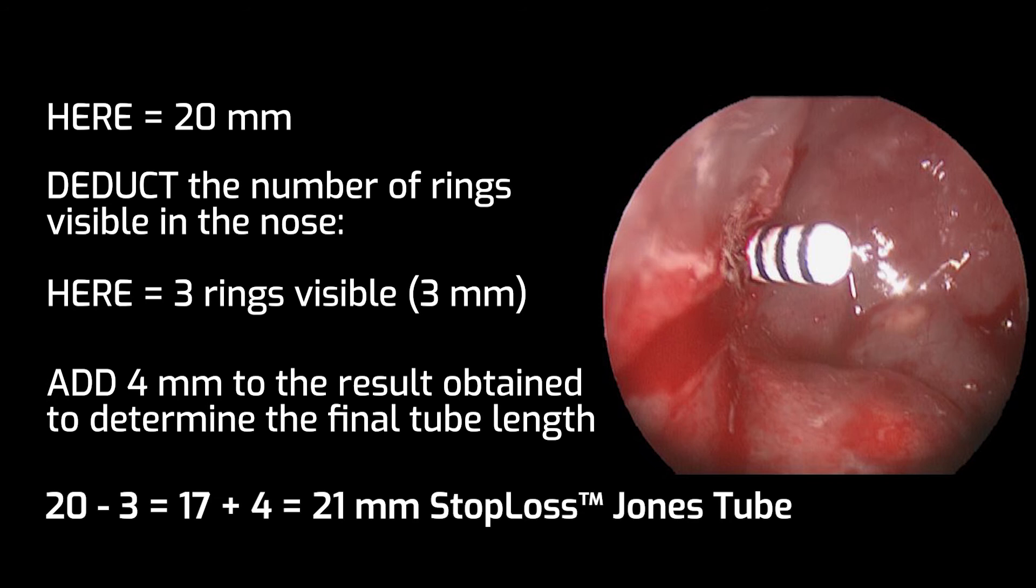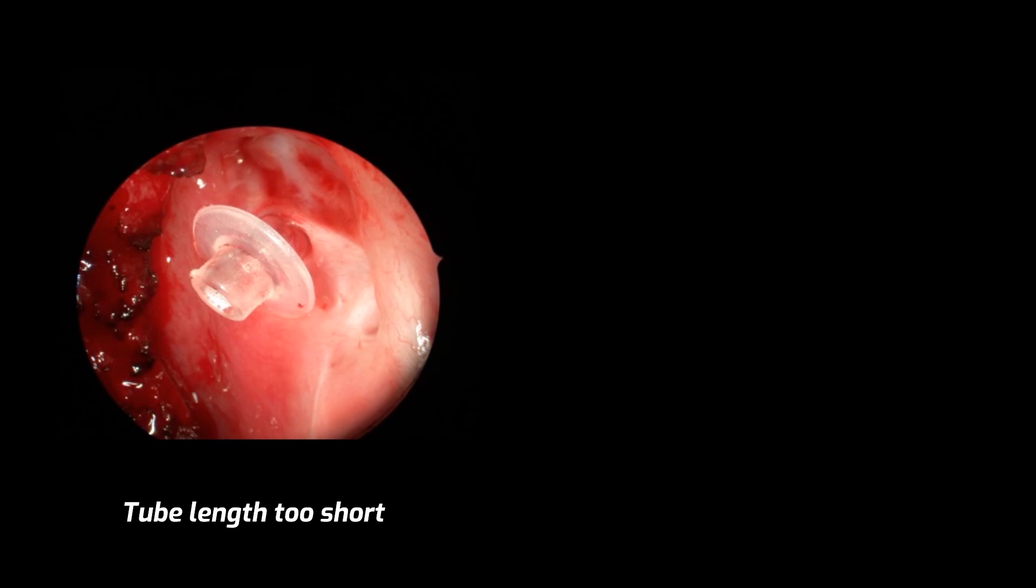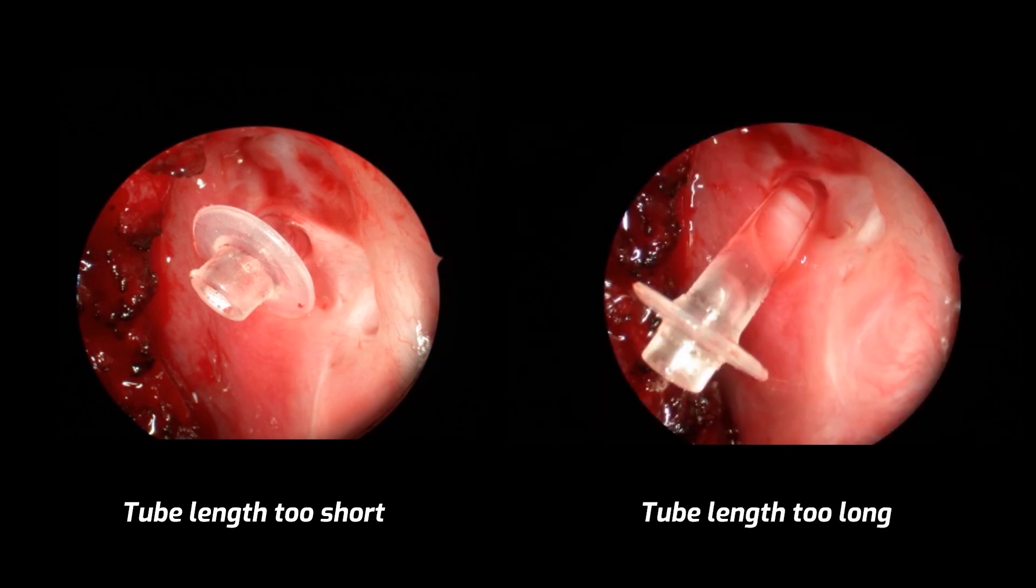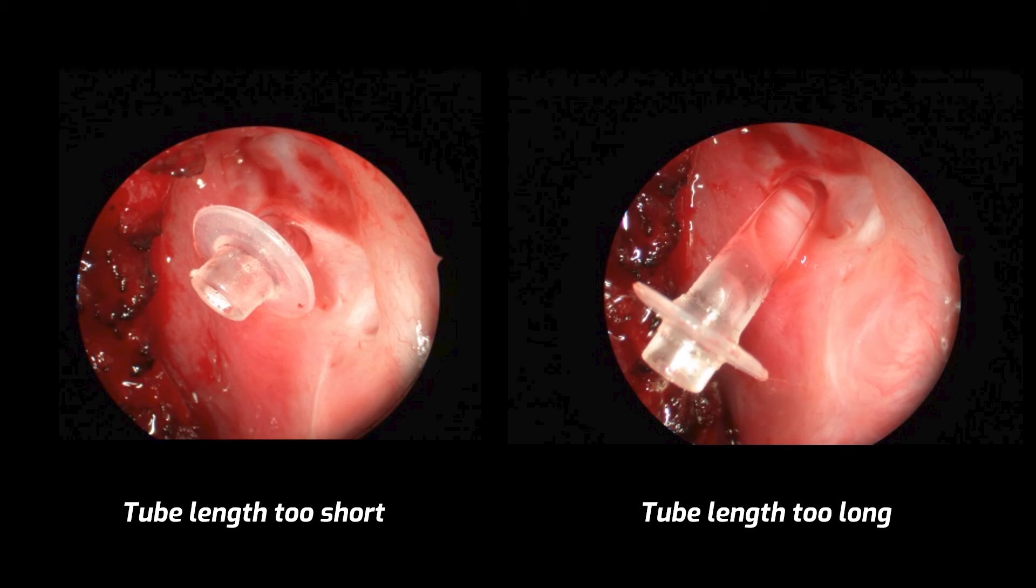The consequence of not following the necessary formula to calculate the appropriate length will position the internal flange either too close to the lateral nasal wall, or the tip of the tube too close to the septum.